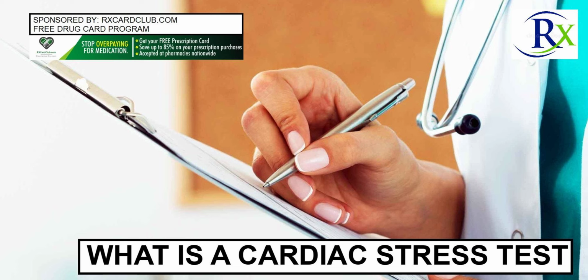On the day of your test, after signing in and confirming your insurance information, you may be asked to provide emergency contact information and to sign a liability form stating that you are aware of the purpose and risks of the test. You are then taken to the stress lab. The test itself is performed by a lab technician or an attending healthcare provider. Pre-test.